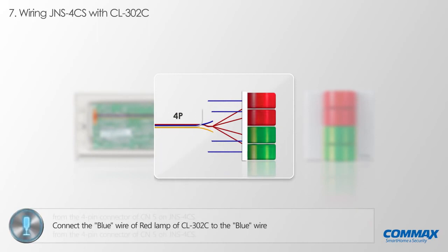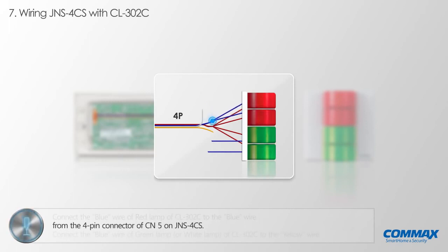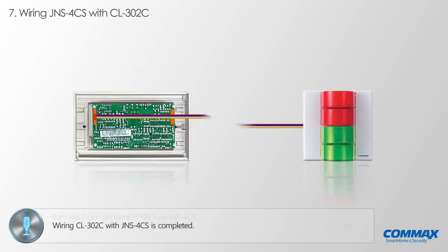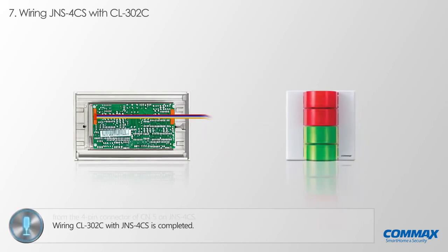Please connect the blue wire of red lamp of CL302C to the blue wire from the 4-pin connector of CN5 on JNS 4CS. Now, please connect the blue wire of green lamp of CL302C to the yellow wire from the 4-pin connector of CN5 on JNS 4CS. Wiring CL302C with a bed console JNS 4CS is completed as shown in the above.